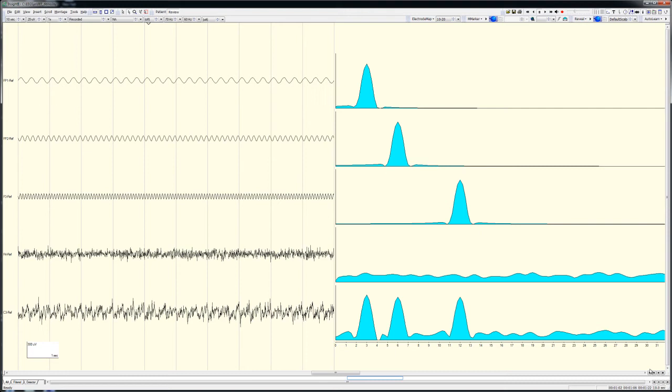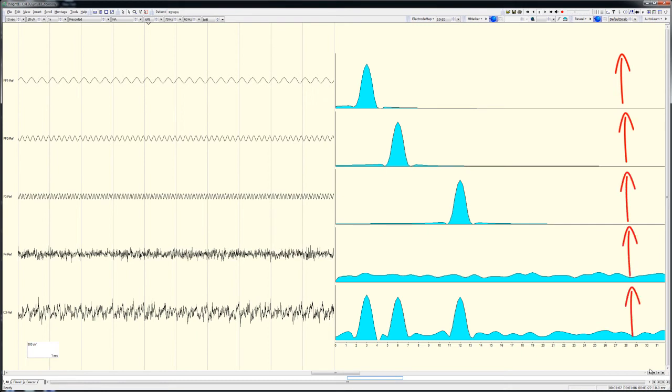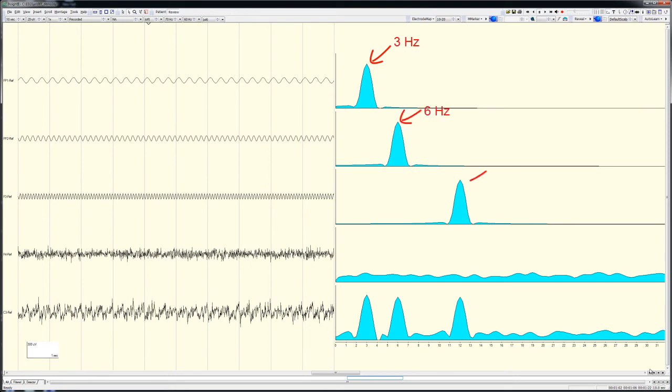On the right are line graphs representing the output of an FFT run on each signal. Frequency from 0 to 32 Hz is shown on the x-axis, and amplitude of the signal at any particular frequency is shown on the y-axis. A discrete peak at 3 Hz is seen for the 3 Hz sine wave trace. Similarly, peaks are evident at 6 Hz and 12 Hz, respectively, for the 6 and 12 Hz traces.